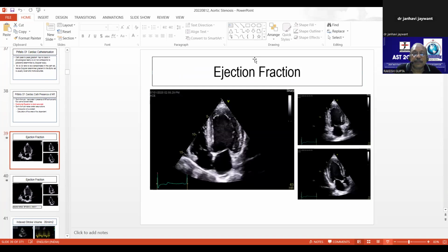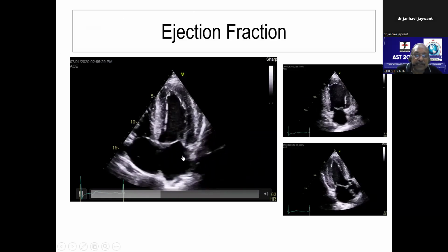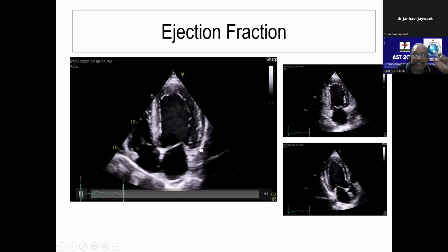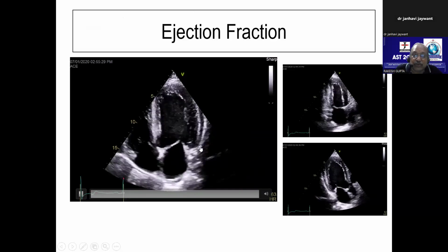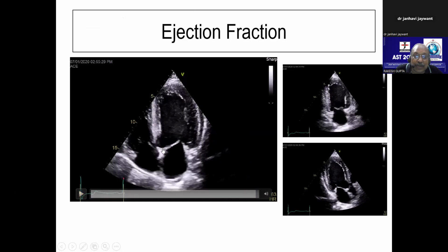That was explained in last lecture also. I am explaining right now because this will help you further also. Now, this is a patient. Suppose this patient has got mitral regurgitation. So we know what is the stroke volume at LVOT. Now in this patient, what I'm going to do is calculate this hinge point and mitral valve diameter.